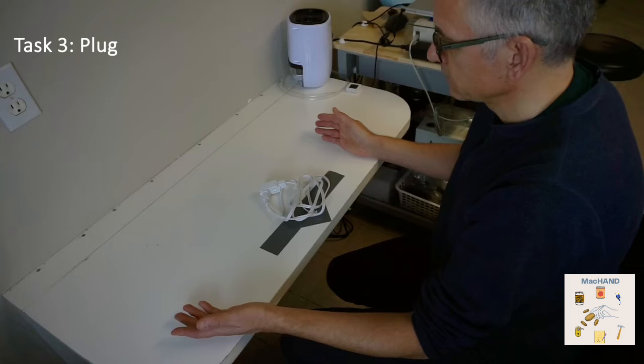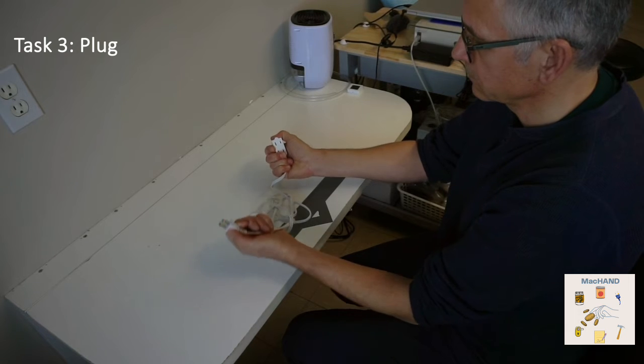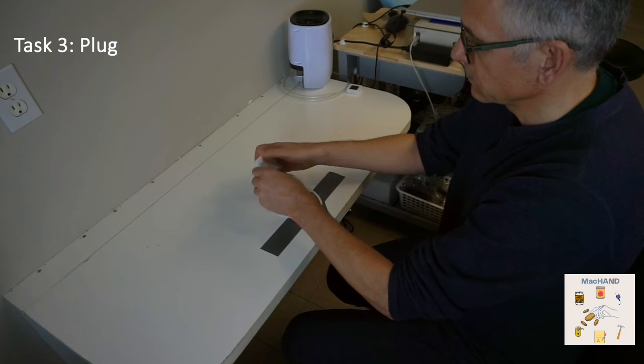This next task asks the patient to pull out and put back in a plug in a socket. The non-tested hand stabilizes the socket, but this can also be done by the assessor. The assessor's focus is on the hand manipulating the plug, performing lateral pinch.